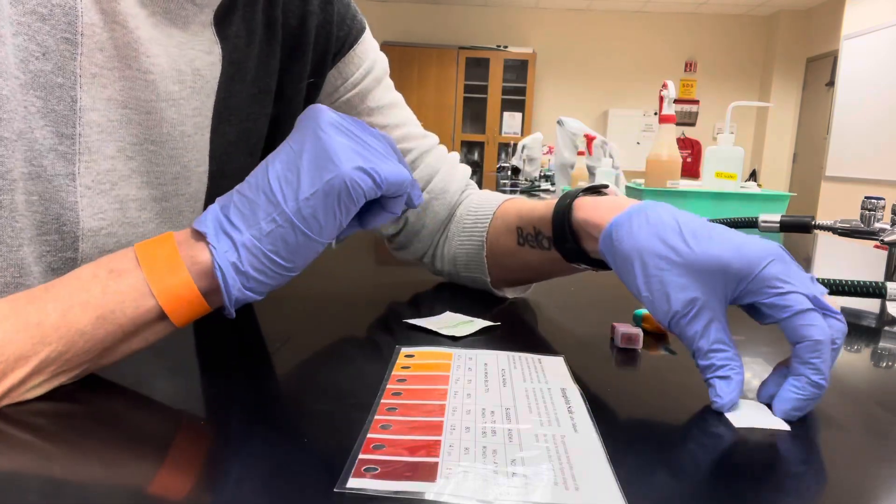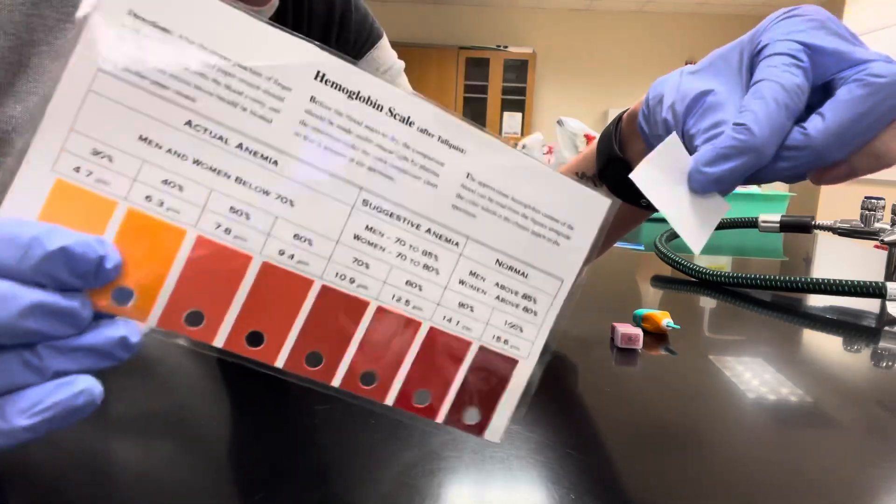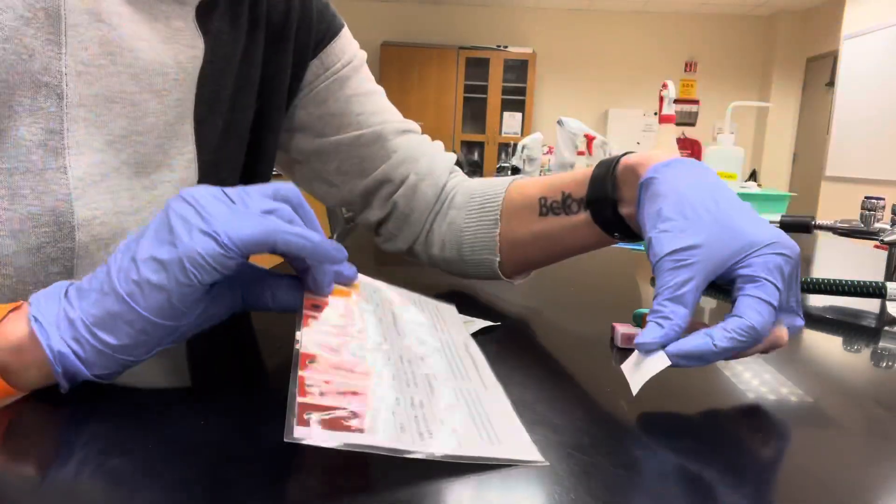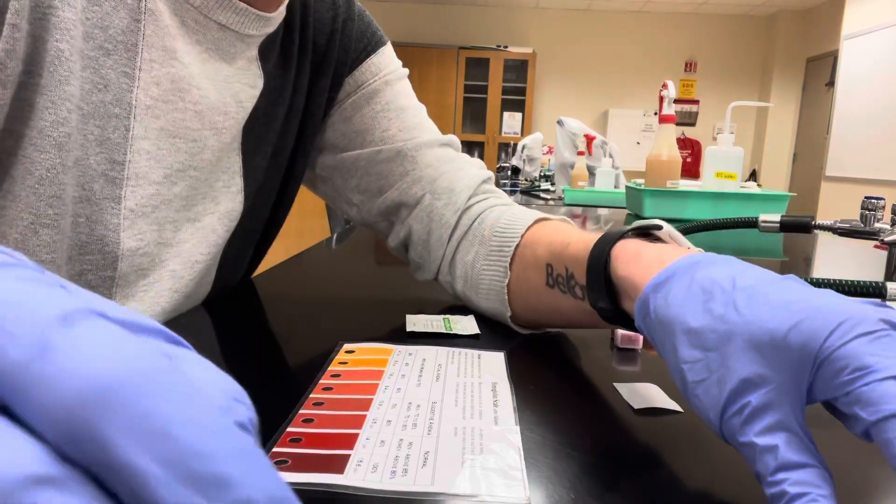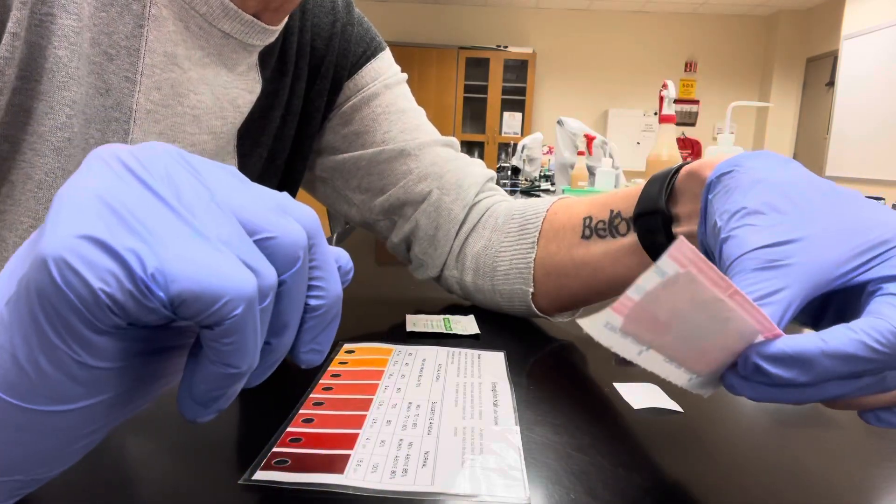You'll need a piece of Talqvist paper and the hemoglobin scale, and then go ahead and get out a cotton ball and a band-aid to tend to your wound.